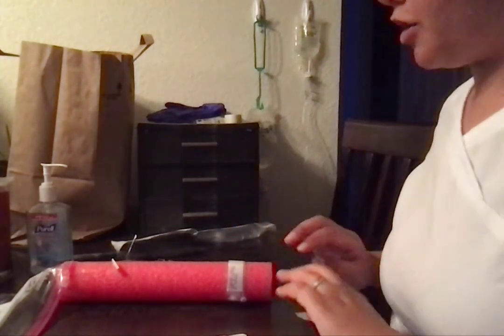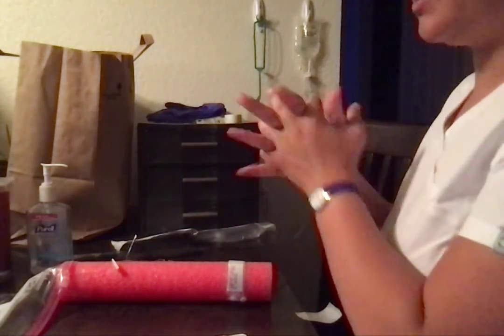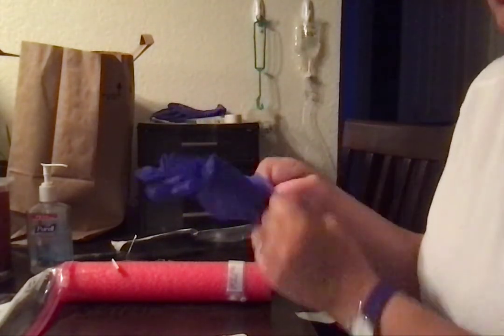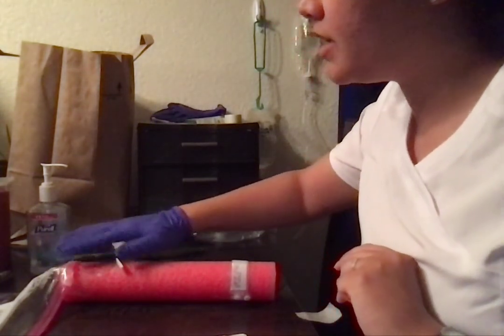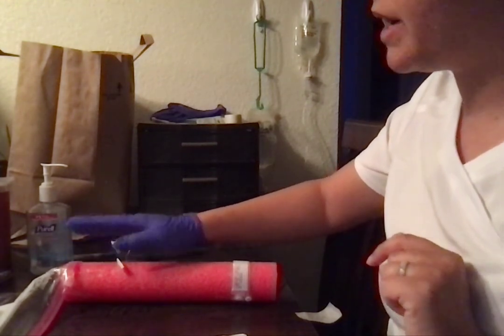All right, so now I'm going to wash my hands and put gloves on one more time to assess my patient. Going to palpate the arm. Any discomfort, Millie? No? Okay, wonderful. I'll be back to check on you.